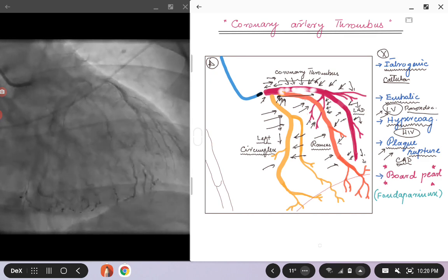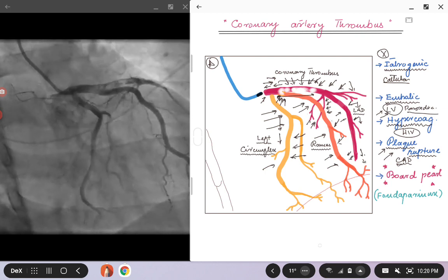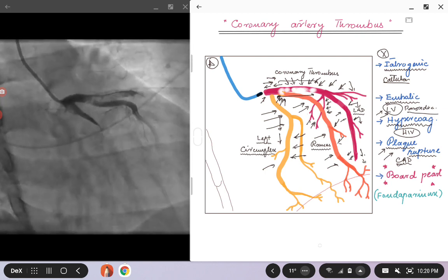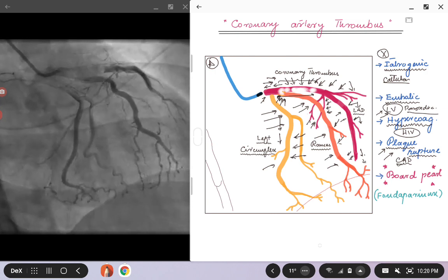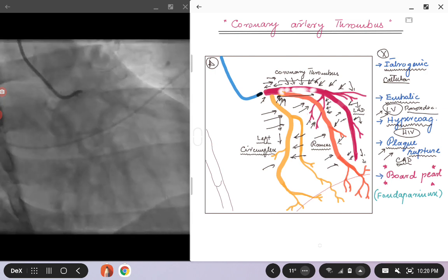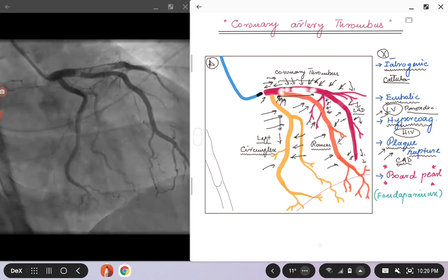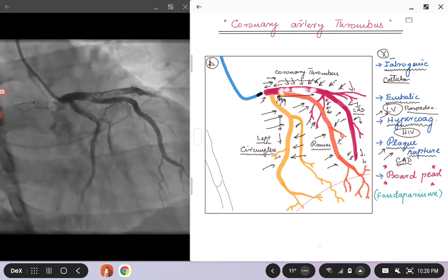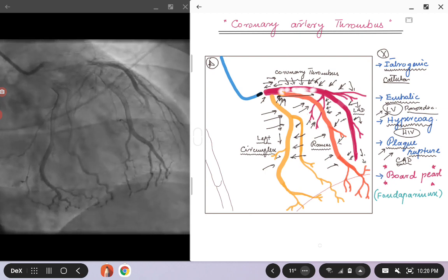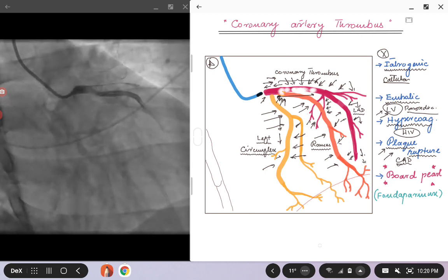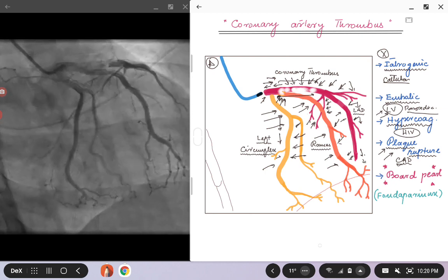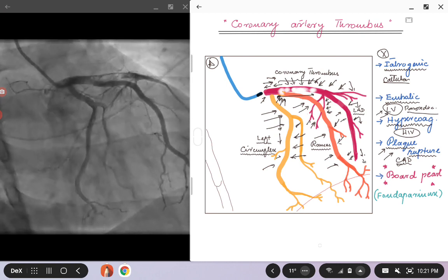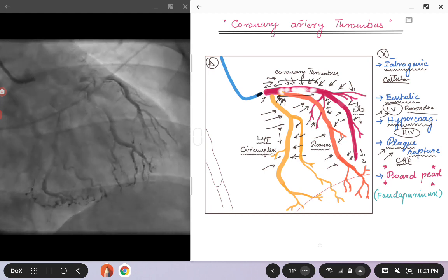It is very unusual to have a plaque rupture with a clot in one artery while the rest of the coronary anatomy is pristine. You might see a clot in patients who have stenosis or diffuse coronary artery disease with a plaque rupture, but if someone like this patient has all other arteries looking very smooth, why would they have a plaque rupture? It's not impossible, but highly unlikely.